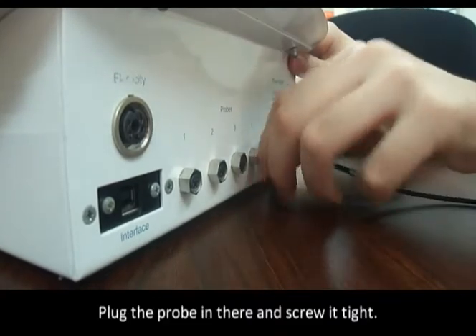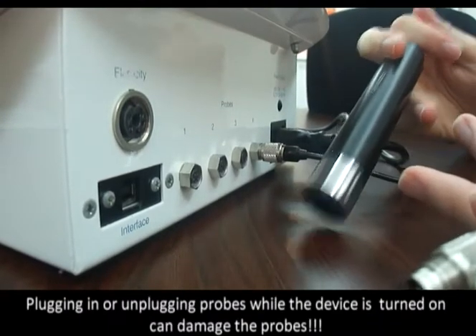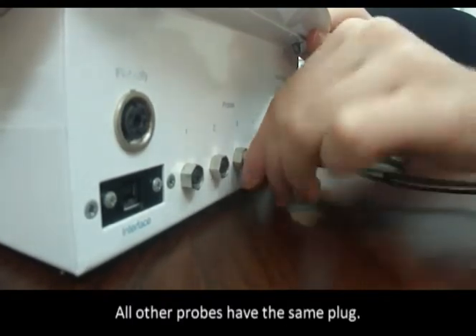Plug the probe in and screw it tight. The software recognizes the probes automatically. Note that plugging in or unplugging probes while the device is turned on can damage the probes. All other probes have the same plug.